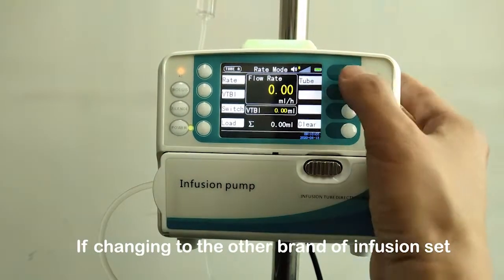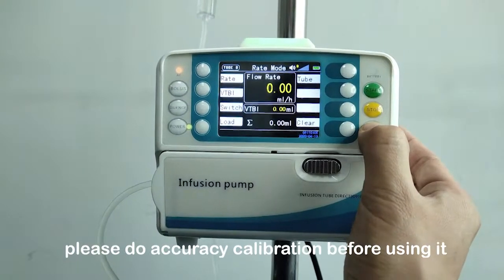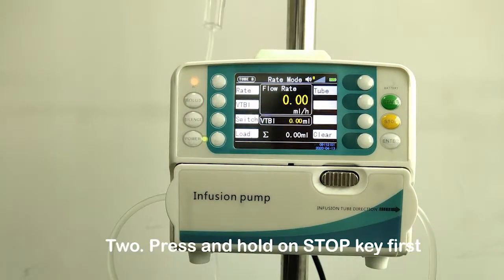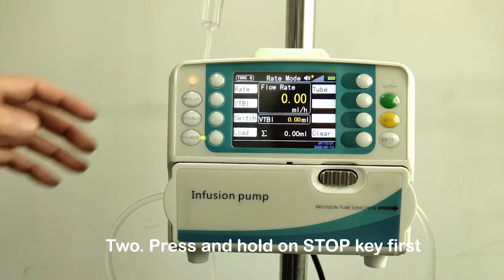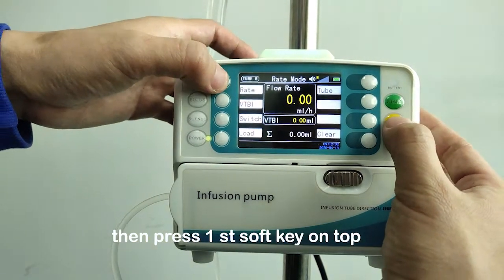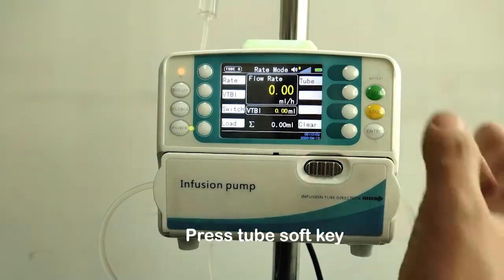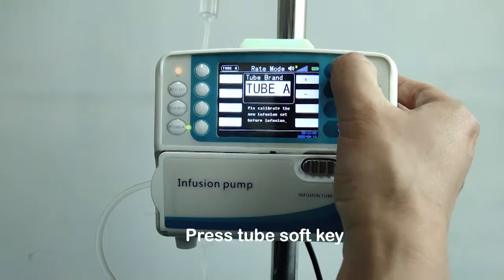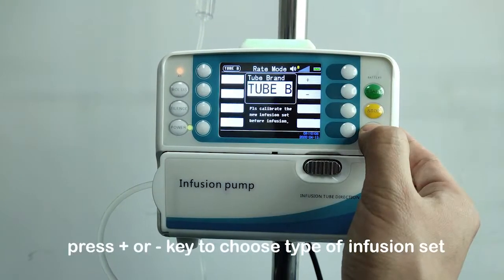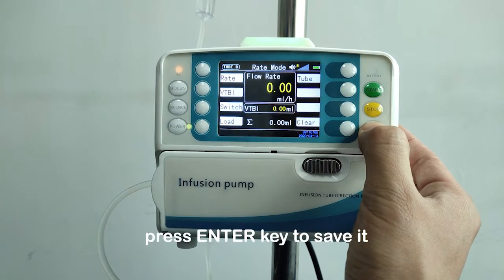If changing to another brand of infusion set, please do accuracy calibration before using it. Press and hold the stop key first, then press the first soft key on the top left to enter the parameter setting interface. Press the tube soft key, then press the plus or minus key to choose the type of infusion set. Press the enter key to save it.